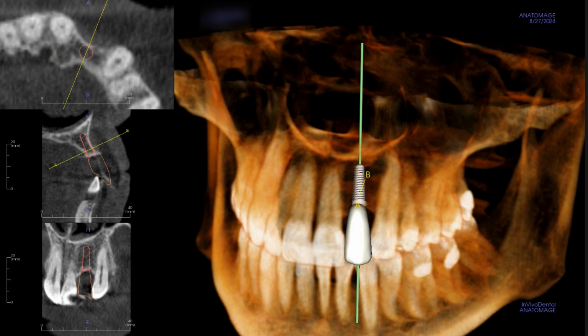In case you were looking for some guidance on implant placement in reference to getting a surgical guide, but just overall guidance on the case. So this patient is a female in her mid to late 40s. The first thing I always want to know is what are the aesthetic expectations of the patient.